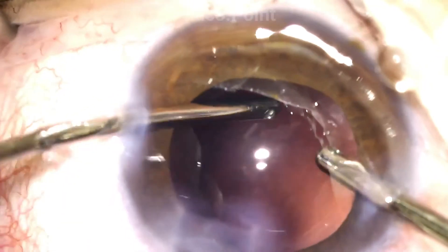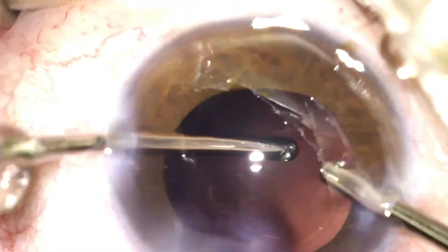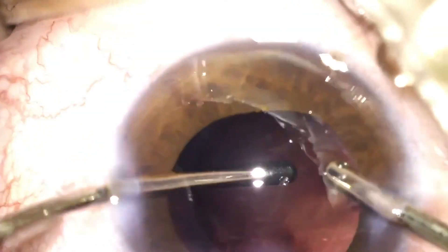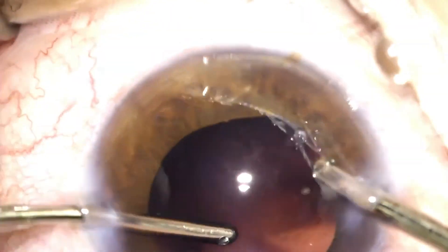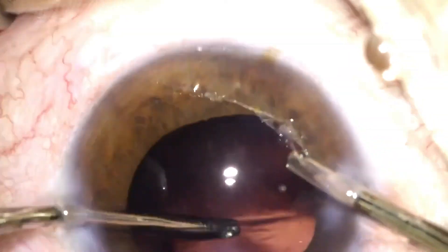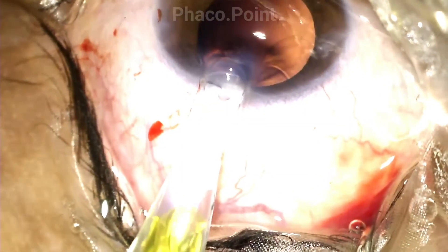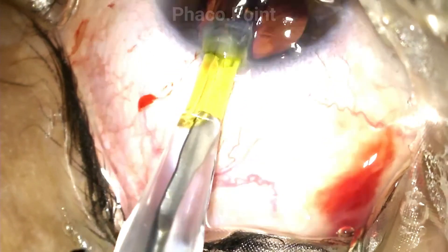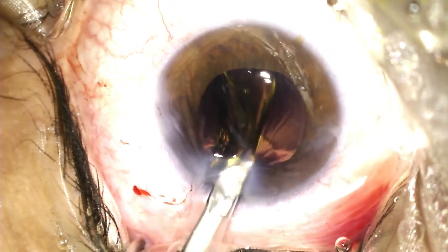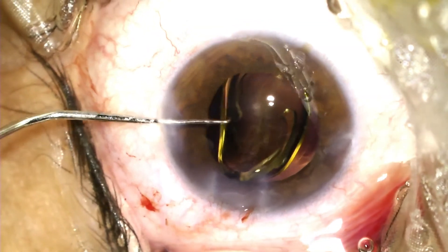Sometimes, however, you may be left with cells that are firmly adherent to the posterior capsule. You do not go and traumatize the posterior capsule in an attempt to remove them. In such a case, it's perhaps best to leave it alone and perform a YAG capsulotomy 3 months following the cataract surgery. Having completed the posterior capsule polish, I now proceed to introduce the IOL within the capsular bag, then remove all the excess viscoelastic, and finally perform a stromal hydration, which brings me to the end of the surgery. I hope you found some of these insights useful.